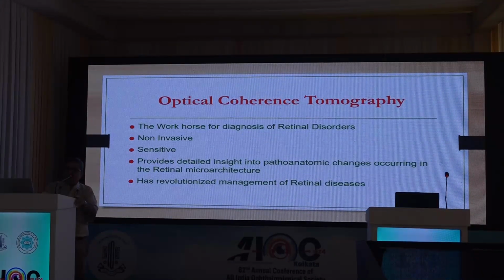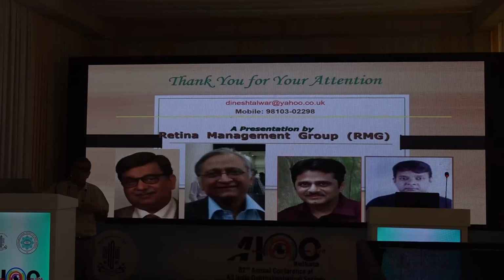So ladies and gentlemen, I've taken a lot of time, but basically OCT is the workhorse for retinal disorders. Diagnosis, management, follow-up. It's non-invasive, sensitive, and provides a detailed insight into the pathoanatomic changes that occur in the retinal microarchitecture and has revolutionized the management of retinal disorders. Thank you very much, ladies and gentlemen.